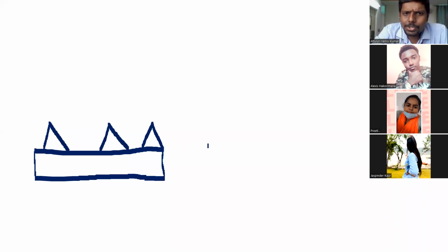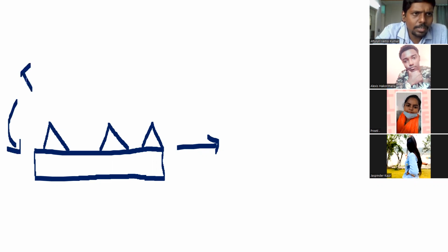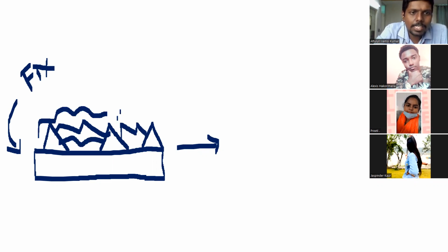But what we did to this tissue is subject it to fixation. Because of this fixation, there is a cross-link formation among the antigens. Because of these protein cross-links, the antigens have been masked and embedded deep into the tissue. Because of this masking, our antibodies cannot bind to the surface of the antigen. That is the major problem with fixation.